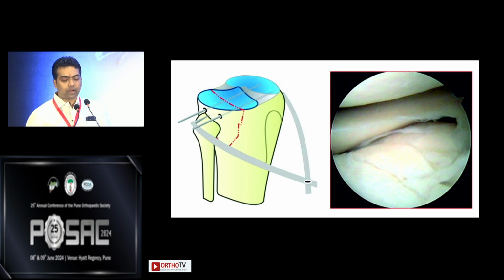This is a split type of fracture. Therefore, you are preloading the K wires in the fracture fragment.